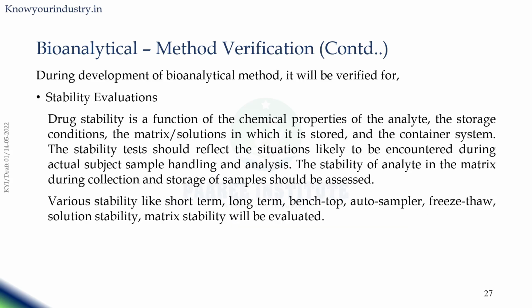Now come to the stability evaluation, which is very critical for the bioanalytical method. This stability will determine how much time you can keep the drug in solution form, neat solution stability, then how long you can store the blood samples, and at what temperature. All those things are determined by the stability evaluation. Drug stability is a function of the chemical properties of the analyte and the storage conditions, the matrix, which are the solutions in which it is stored, and the container system.